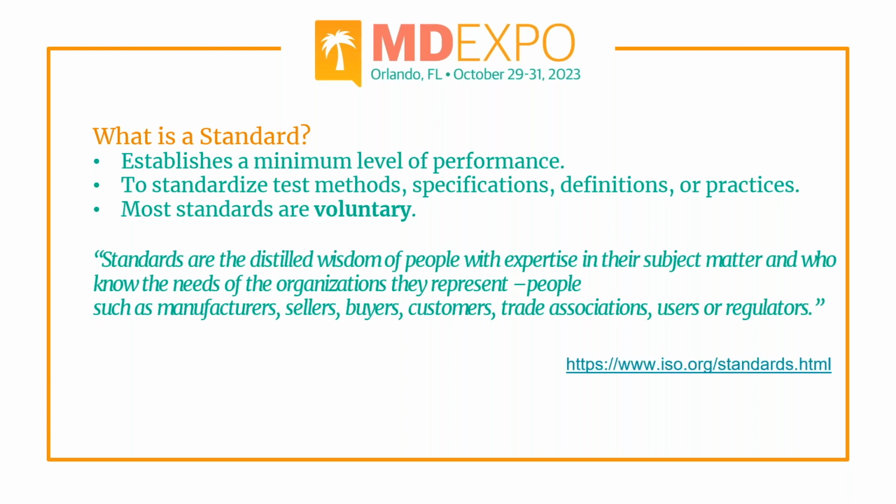This is a piece taken from ISO. Basically, it says standards are the distilled wisdom of people with expertise in their subject area who know the needs of the organizations they represent. When these committees sit and develop these standards, they have people representing different aspects of that particular product requirement. So they could be manufacturers, sellers, buyers, customers, the trade association, the users, and even regulators.